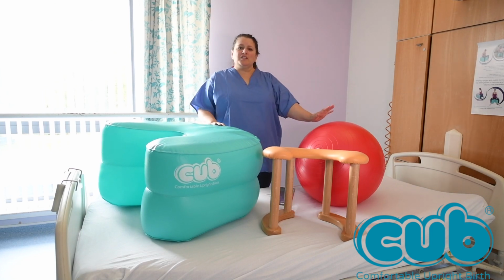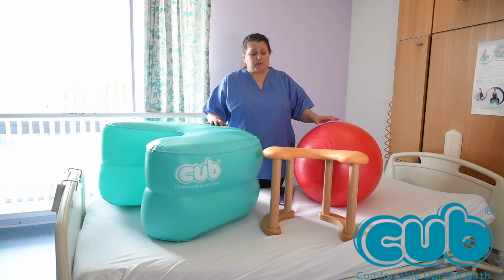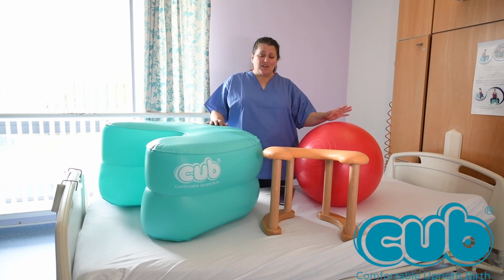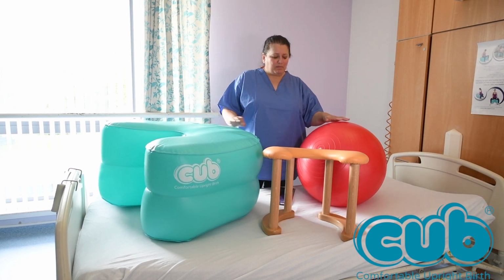Hi, so I want to just talk a little bit about the difference between the CUB, a birth ball and a birth stool. These are very common questions that people ask us. So we'll start with the ball. This is quite a small ball, but it's just easier to use for the filming.